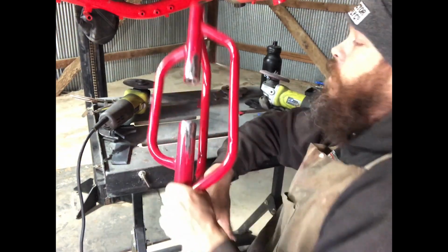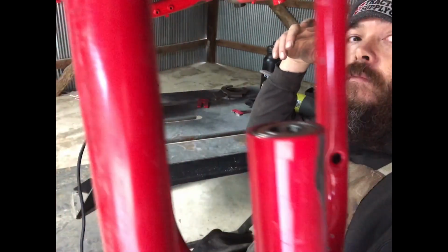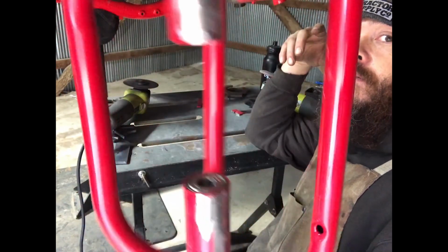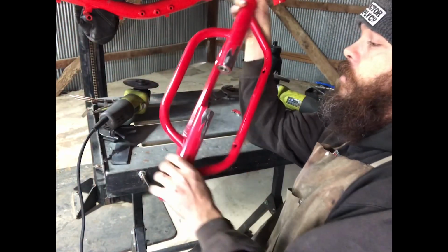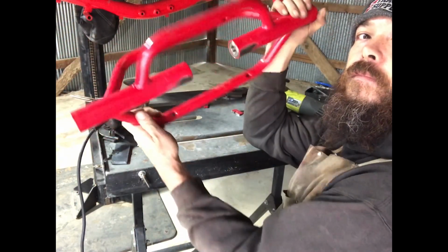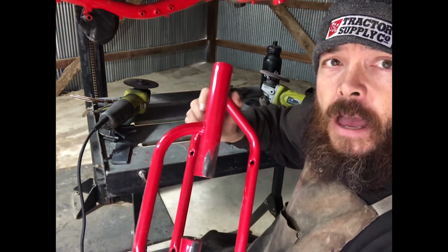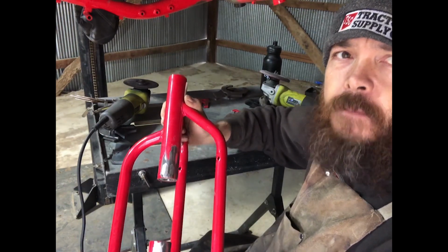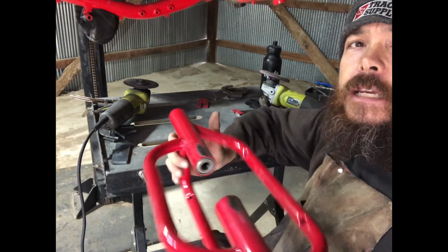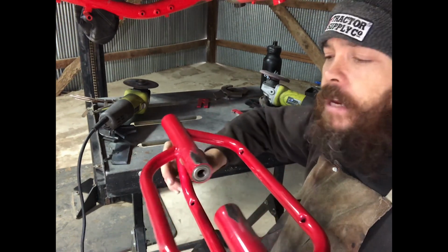Just got this all finished grinding up. Nice and clean. Ready to weld. So now that we have that done, now we just have this cage by itself. I guess I could build these from scratch, but it'd take a lot more time to bend and jig and set all this up as opposed to just buying one and then modifying it.